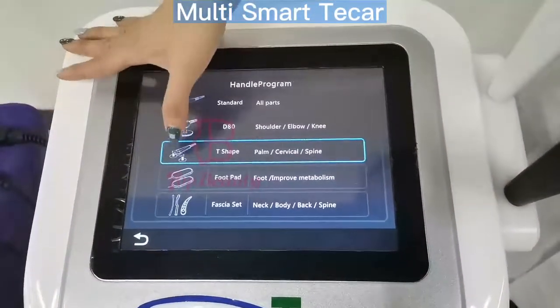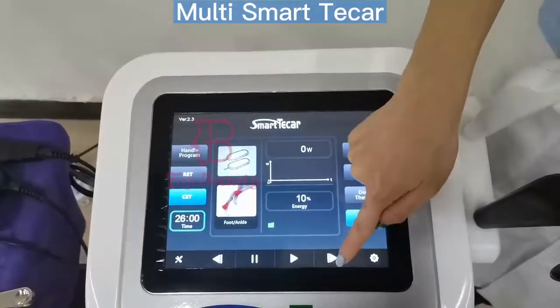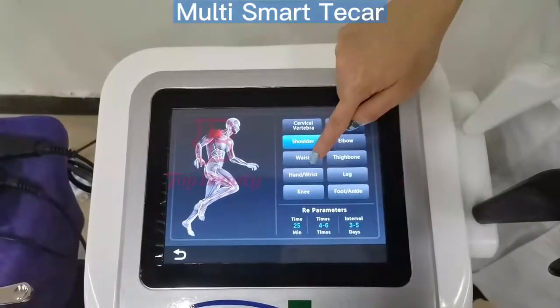And for the foot pack, you can also see the working time setting and energy setting.